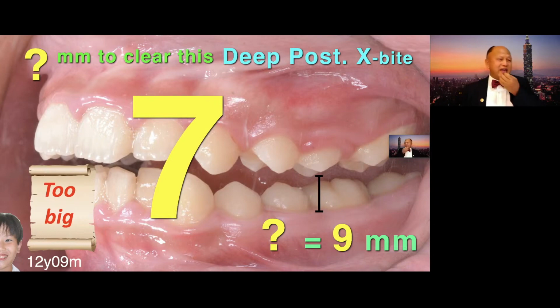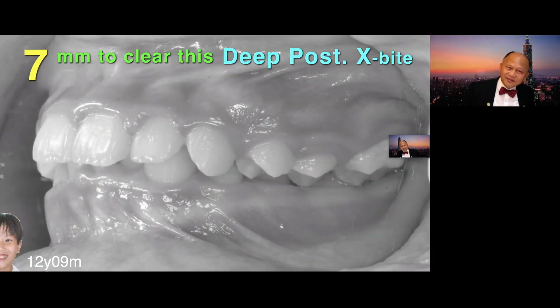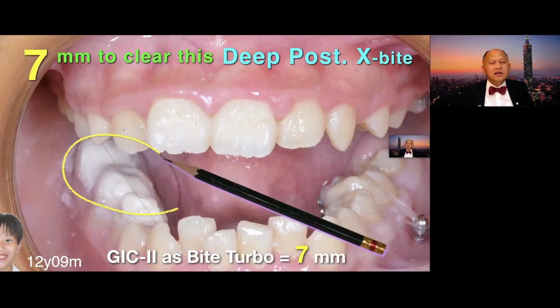So I take a wild guess, 7 millimeters is probably enough to clear this deep posterior crossbite without opening up too much, because the patient will not be comfortable with a huge open bite. So we decided to open 7 millimeters. Why? To clear this deep posterior crossbite. So we open up 7 millimeters right here, with posterior bite turbo.